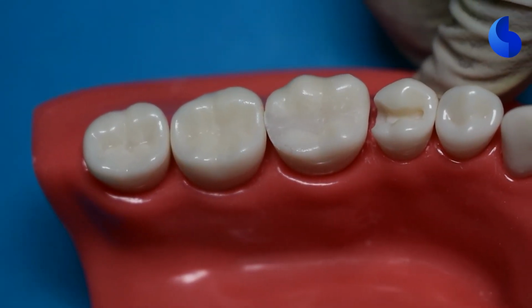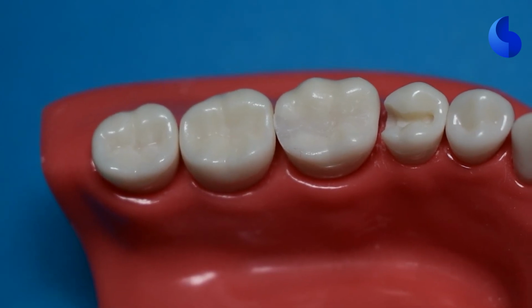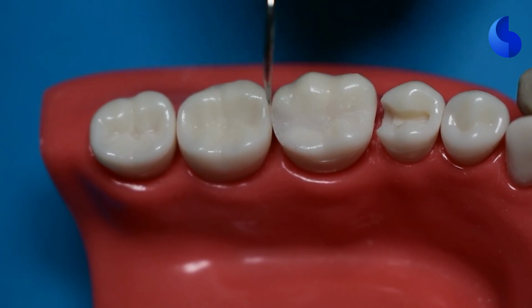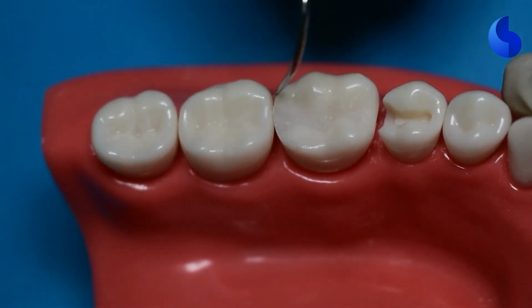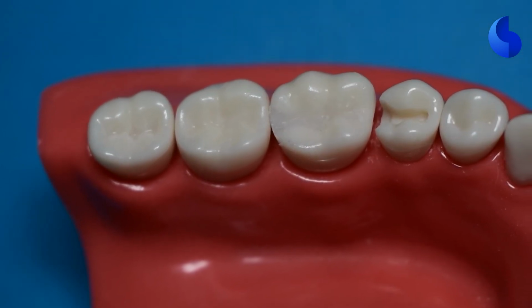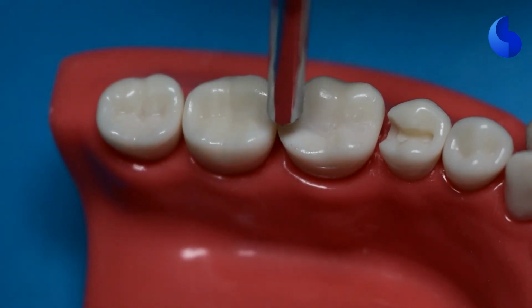So at this point, you can use something like IPC, the interproximal carver, which is really smooth and sharp, or the tip of the explorer. A better instrument to use would be the IPC, and just use that in that area to remove that sharpness. Using a burr would be a little bit risky because you might damage the adjacent tooth. But you can see that even the tip of an explorer did a good job at removing that sharp ledge of composite material.